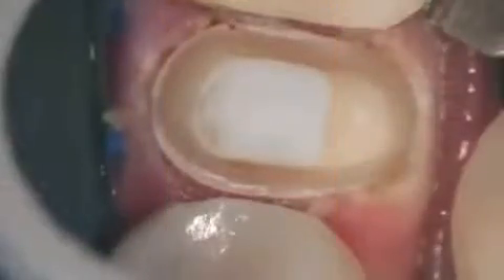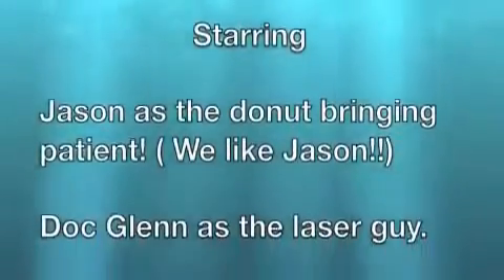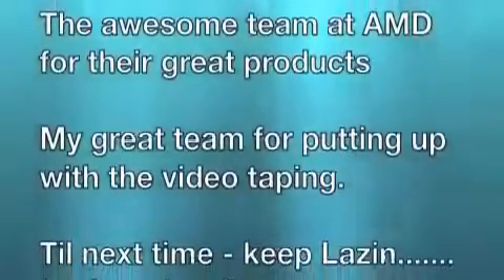Here we are now with a photo of the tooth just before the impression is done — it's dried. There's the tooth after bonding, and the labial view to show the inter-occlusal clearance. Now the impression at low magnification and at high magnification to show how clearly viewable the margin is. There's your provisional. I want to close by saying thank you to Jason and the awesome team at AMD for their great products, and to my dental team for putting up with me. Keep lasing — it's amazing.